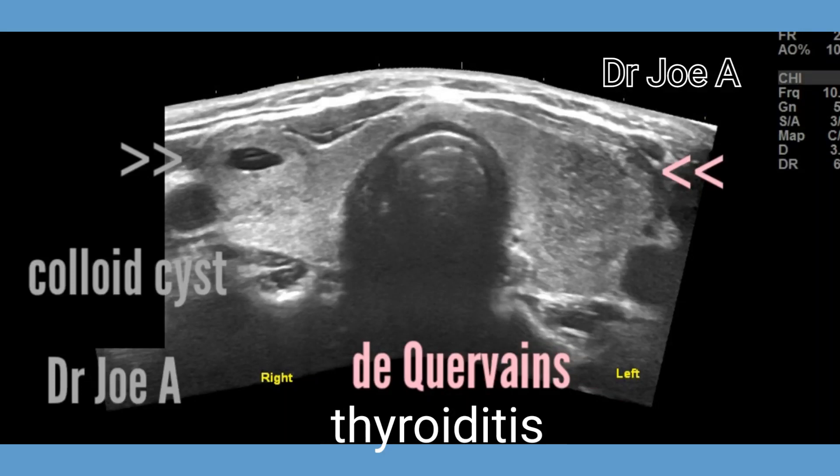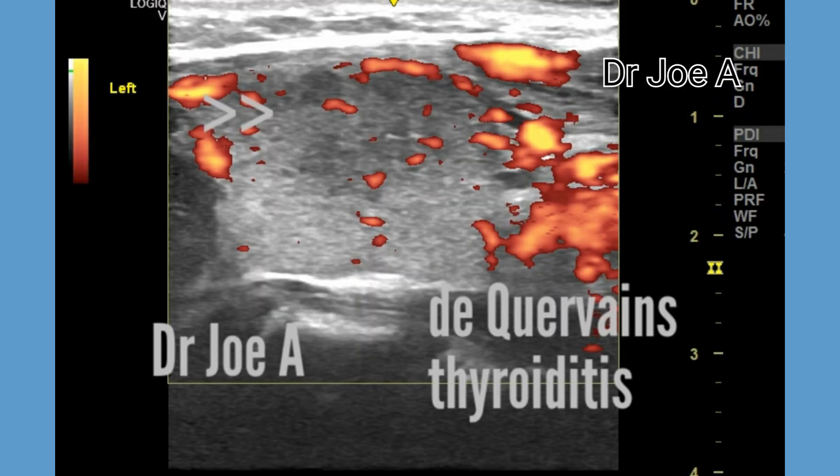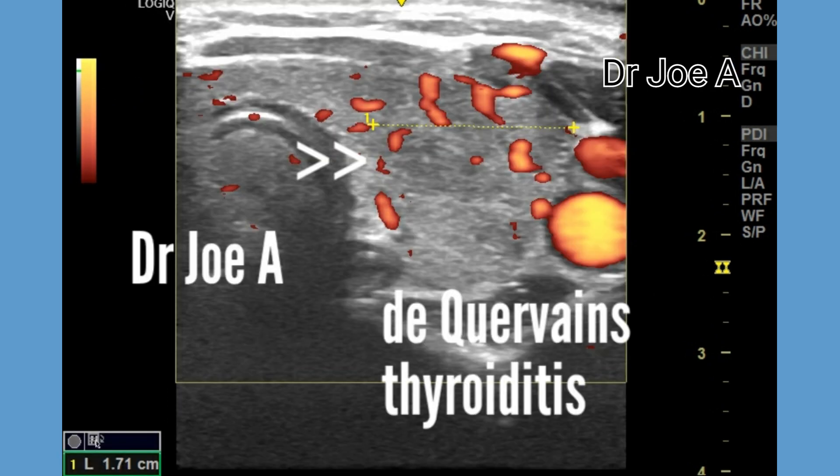This is a case of De Quervain's thyroiditis, also known as subacute granulomatous thyroiditis, affecting the left lobe of the thyroid in this adult female patient. In addition, there is also a colloid cyst of the right lobe of the thyroid.